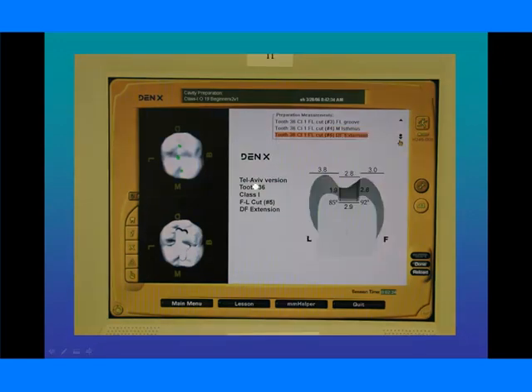And the last cut is our distal facial cut. This cut comes through the tooth in this area here. You'll notice that the width of our floor is 2.9 millimeters, 2.8 on the occlusal. Basically 2 millimeters deep. The reason this one is closer to 3 is because this part of the preparation does go up on the cusp tip a little bit, which makes it a little bit deeper, or seems to be deeper. And our angulation of our walls, our facial wall or buccal wall, actually diverges a little bit, and our lingual wall converges a little bit.